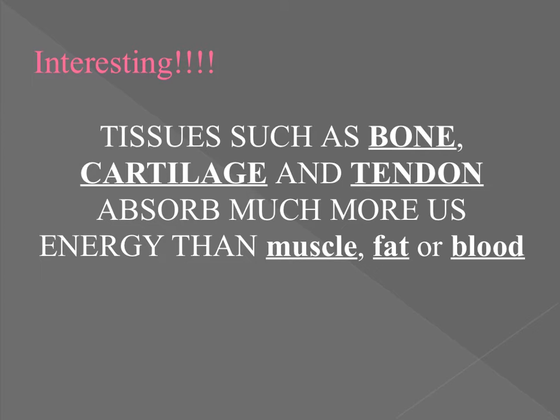If our goal is to get to the muscular layer and we're doing that through a bone or through a tendon, just note that a lot of your ultrasonic energy is going to be absorbed by those tissue structures, right? So we just have to be thoughtful about where we are ultrasounding. I am not saying that ultrasound is not effective for muscle. I am not saying that at all. I'm saying that if you are trying to ultrasound a muscle that lives deep to a tendon, it may be very hard to get energy absorption for the muscle. It's very rare in the human body. However, most muscles are just covered by the dermis and epidermis. So in that case, we just need to make sure we clean our patients relatively well.